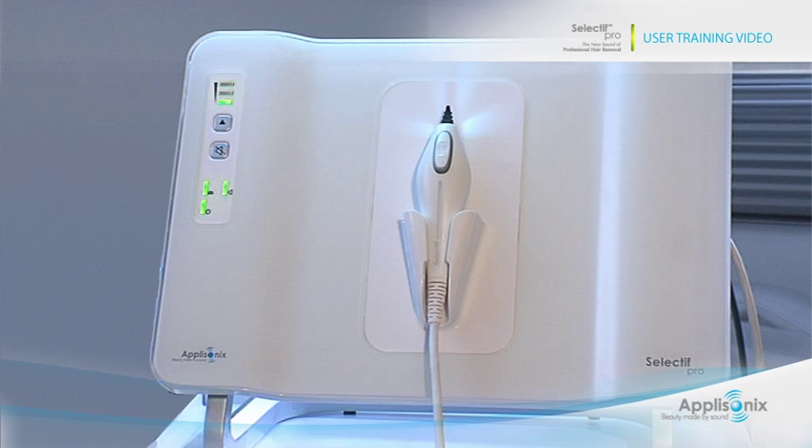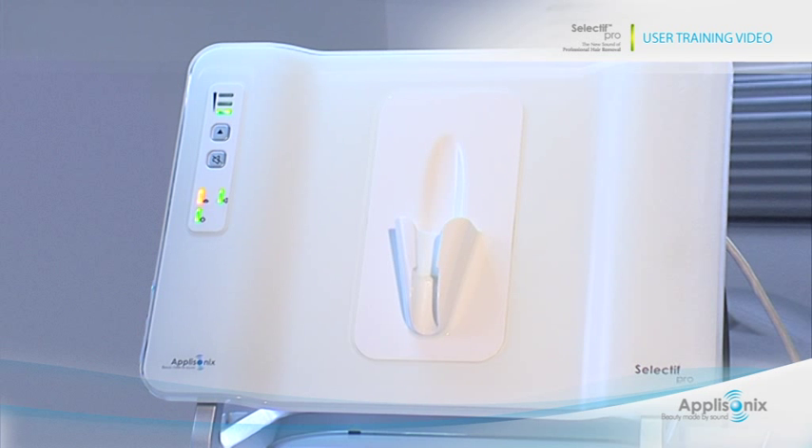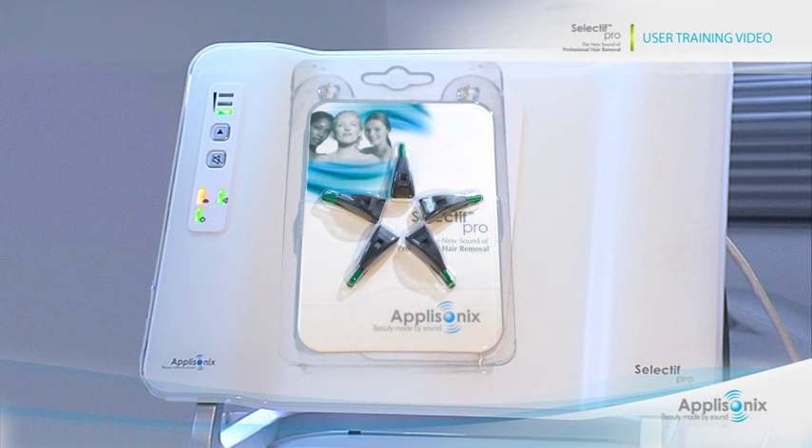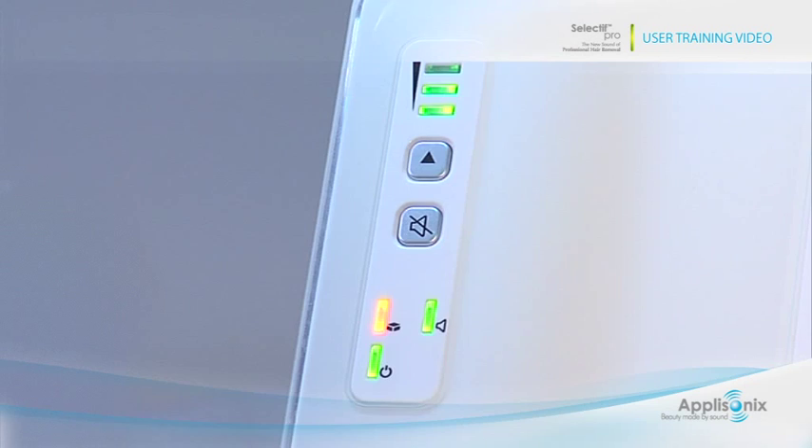The Selectif Pro system will provide an advance warning for replacing the lower gripping tip or the entire probe. The indication is provided by the system's status lights and the three mode lights on the front panel. The system will alert when the gripping tip reaches 90% of its capacity — the status light will blink rapidly in orange. You may continue working as before, but make sure you have additional gripping tips or place an order. When the gripping tip reaches 100% capacity, the status light will turn to static orange and modes A and B will be blinking. You will not be able to trigger any more pulses.